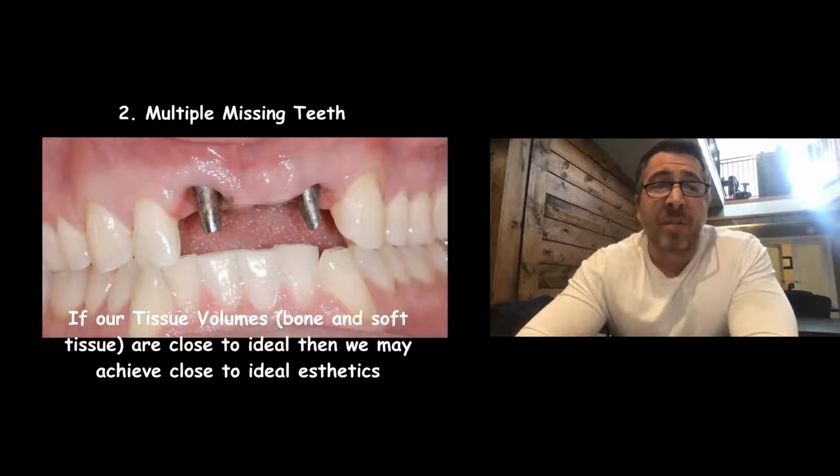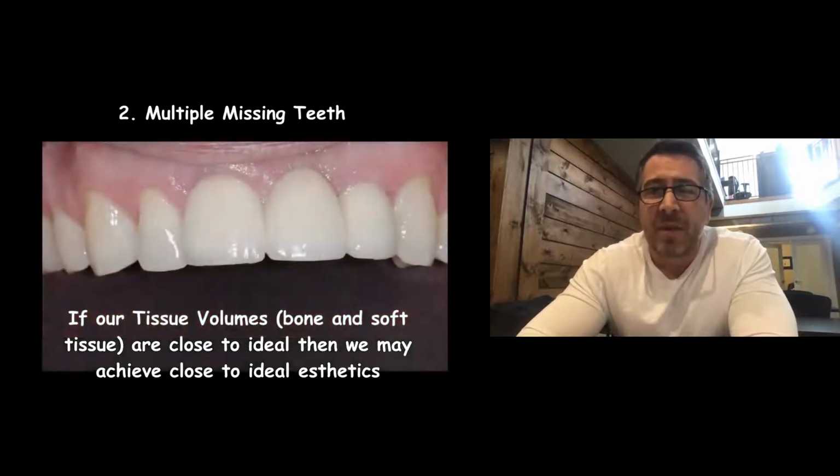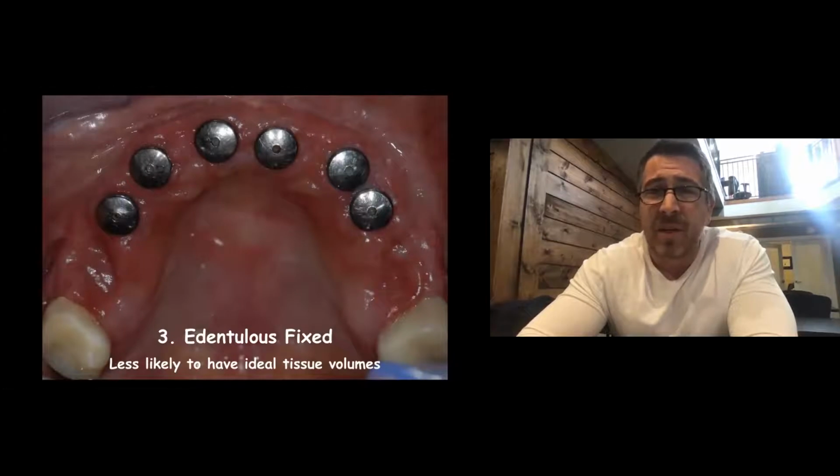When I have multiple missing teeth, and we're talking about a bridge, if our tissue volumes are adequate, so if we have adequate bone and soft tissue, then we can usually accomplish a pretty aesthetic result as well. Now, if we have deficiencies in those tissues, whether they're bone or soft tissue or both, we need to identify those in advance to understand what kind of aesthetics we're going to result in.